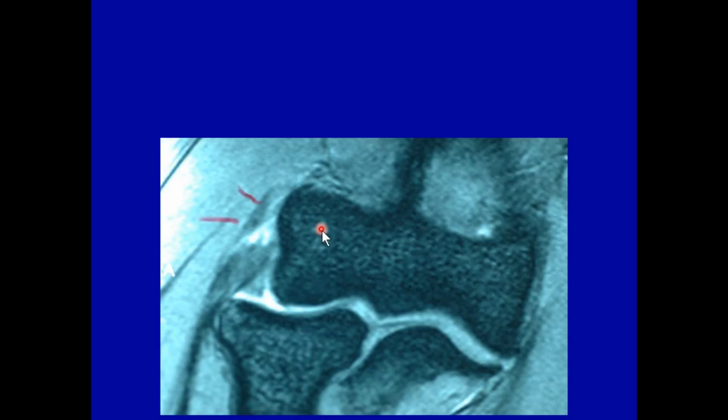But it still goes back to the x-rays were normal. Can you provide highly diagnostic films, AP and lateral? And then understanding that an MRI is always a more sensitive tool. It gives you more detail, but then we talked about the costs associated with that.